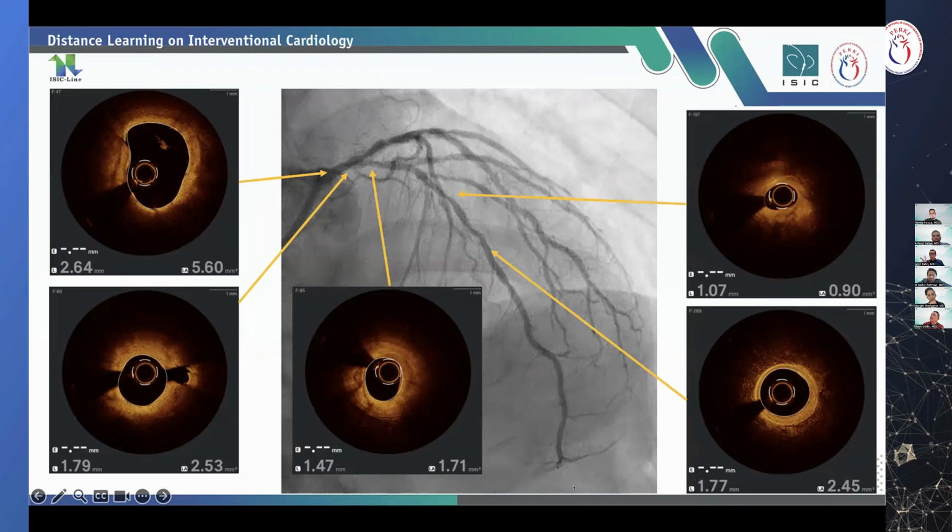And I think that regarding what Dr. Noriaki said about side branch compromise, the risk might be calculated as low in this case, because the OCT data show there is no huge calcium that might be considered for carina shift, even though the left main is quite short. That's all, Dr. Fauzi.